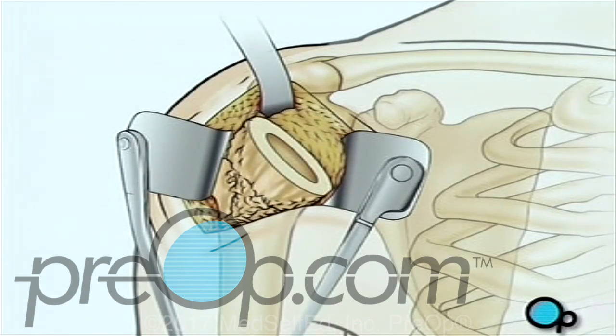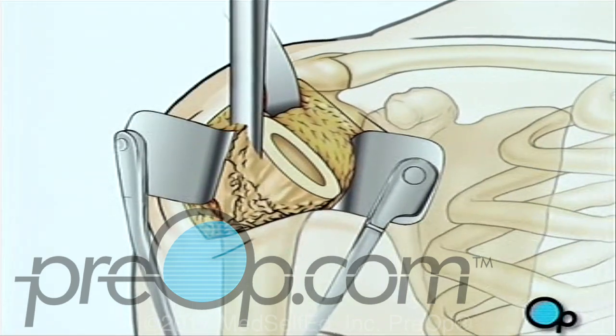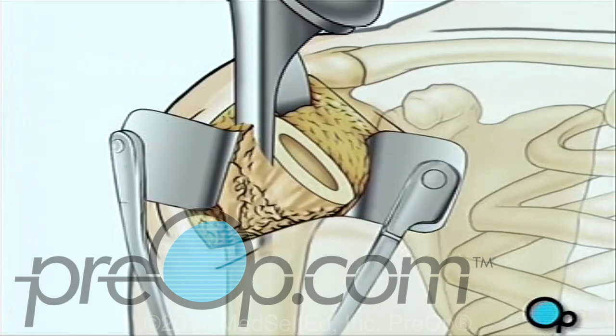Then, the surgical team will use a high-speed drill to hollow out the top of the arm bone. A specially fitted artificial ball joint slides into the top of the arm bone.